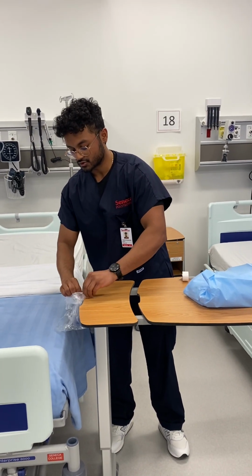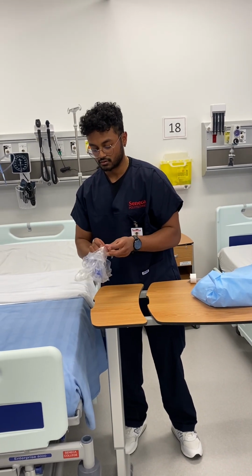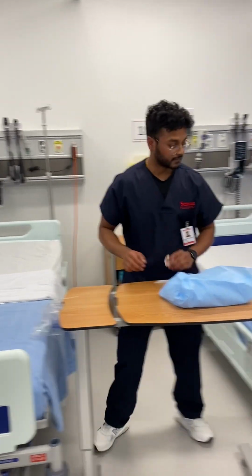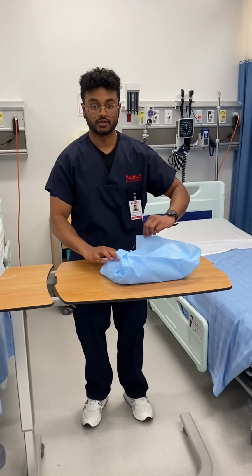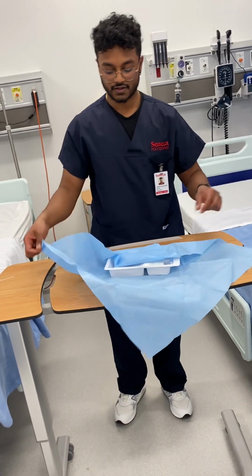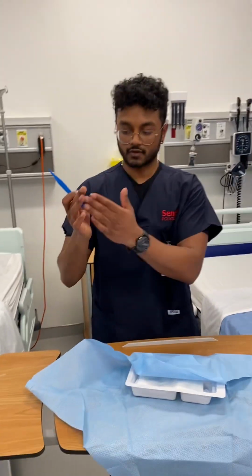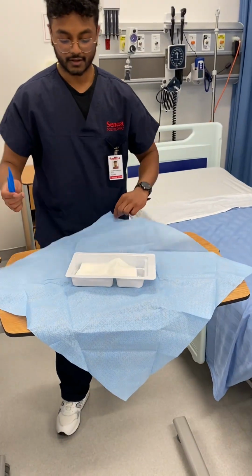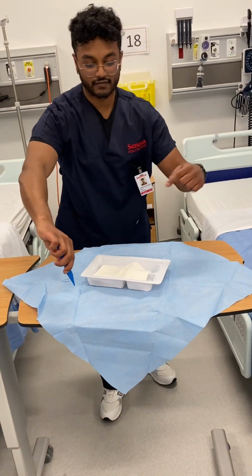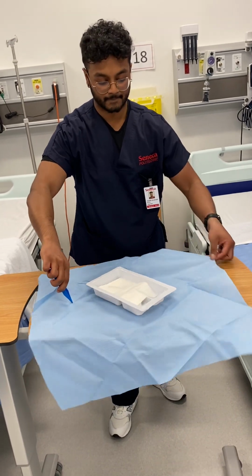Taping our trash receptacle to the side, making sure to keep it between us. Now we begin by unfolding forward, to the side, to the other side. On our last fold, we grab our forceps, knowing that it's sterile at the tip, clean at the bottom, and unfolding back. We want to orientate our sterile field so as to have overhang on the side so it doesn't touch our scrubs, compromising sterility.